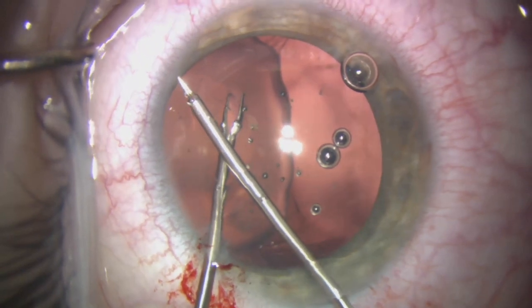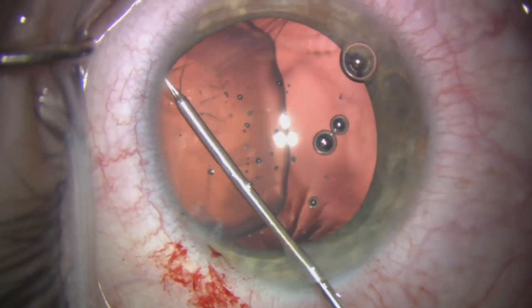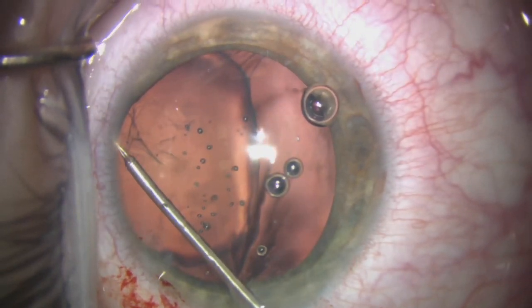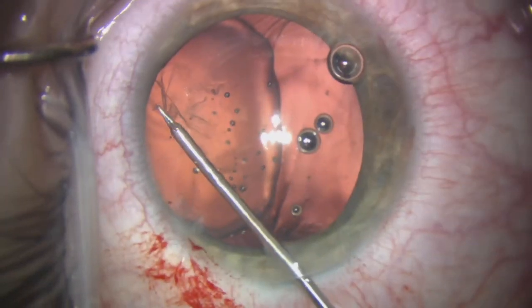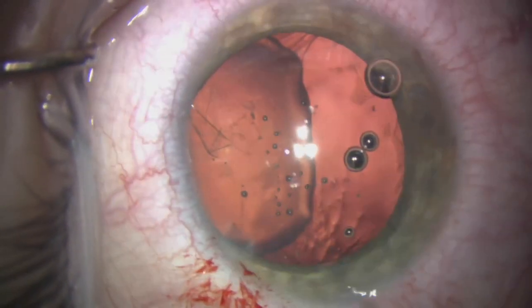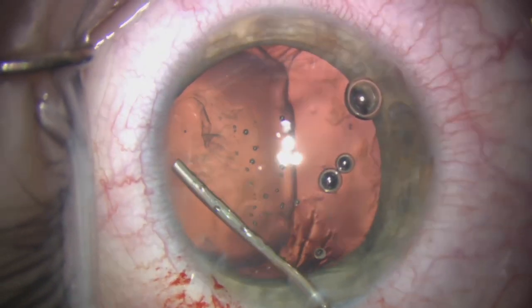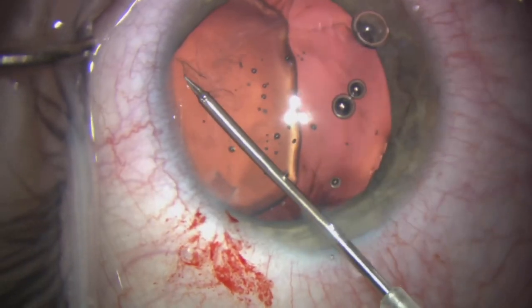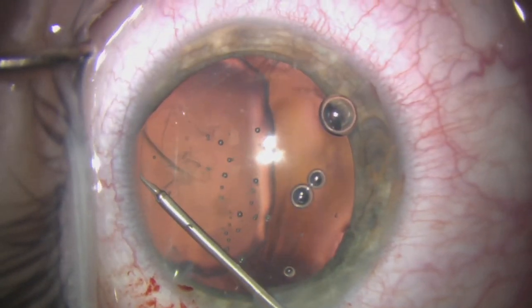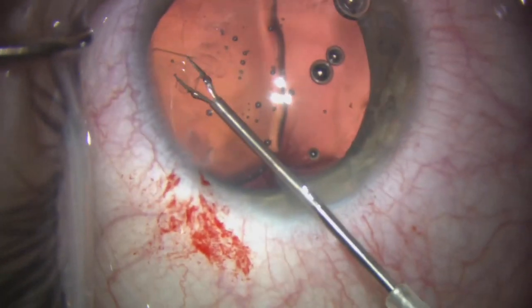A little bit of counter-traction with a second pair of micro graspers helps to propagate the rhexis, and we continue to tear it counterclockwise very gently. We use additional Helon 5 to flatten the capsule and push the iris away a little further to improve visualization of the edge of the tear as we proceed with the capsulorrhexis.